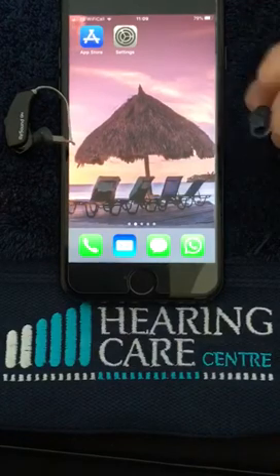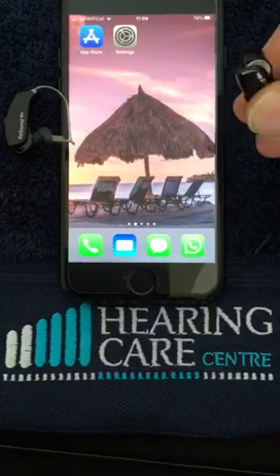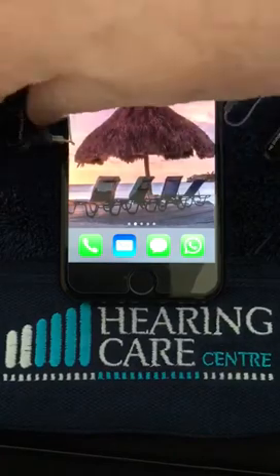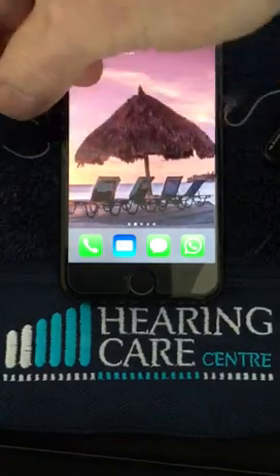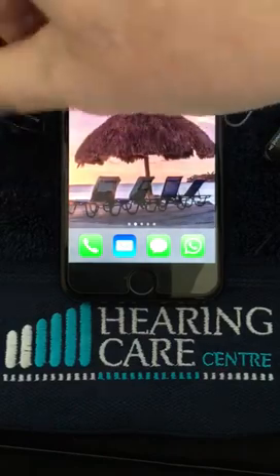The first thing we need to do is switch the hearing aids on by closing the battery door, or indeed taking the hearing aids out of the charger if you're using rechargeable hearing aids.